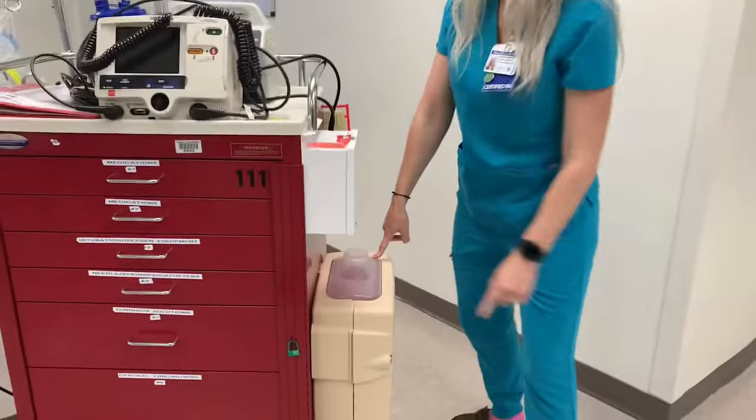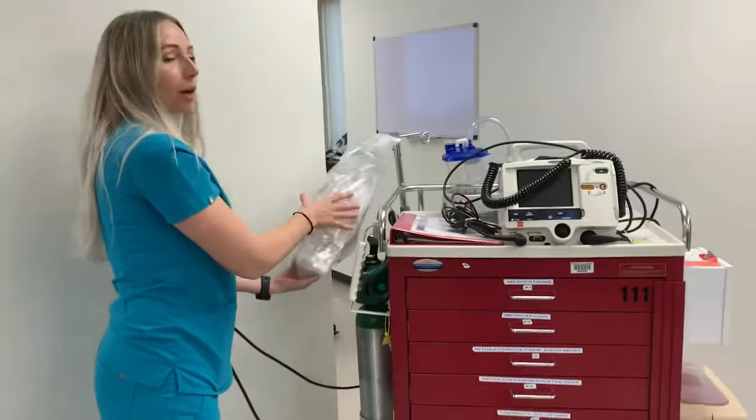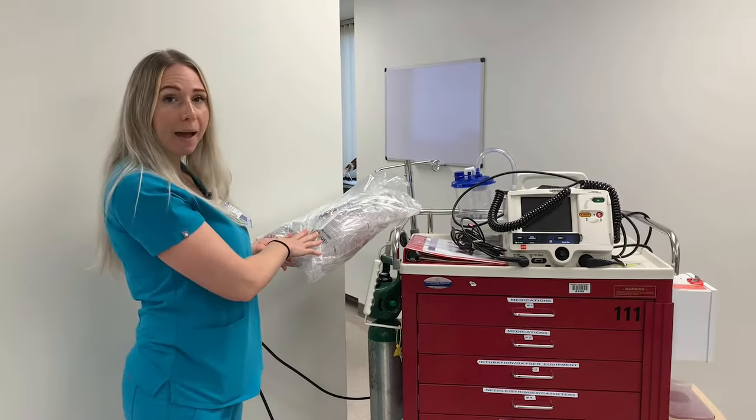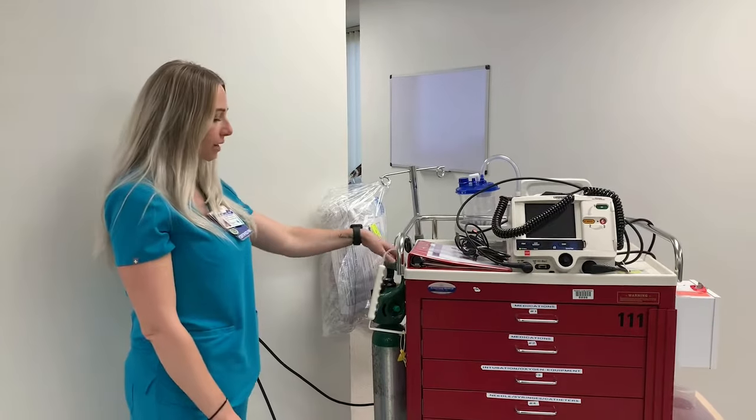We have a sharps container right here. On the other side we have our bag with all of our respiratory equipment. There's an ambu bag in here, there's also an extra pair of defibrillation pads, and then there's some suction tubing. You have an oxygen canister on the side.